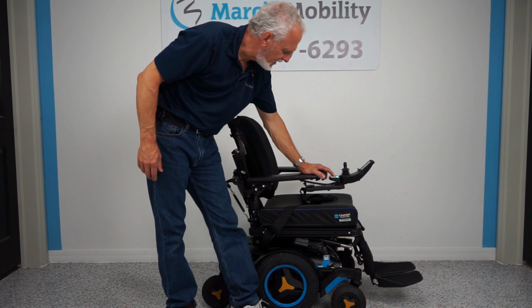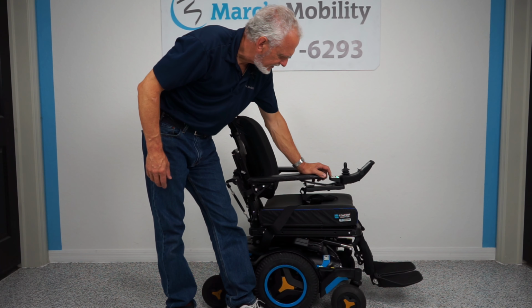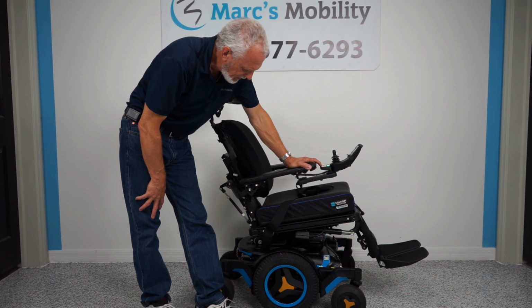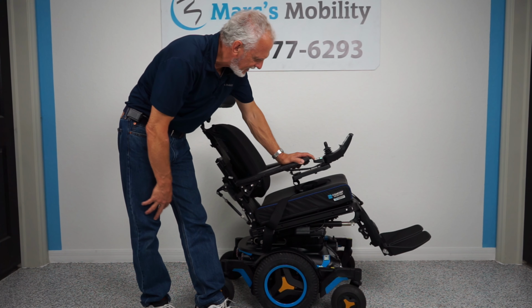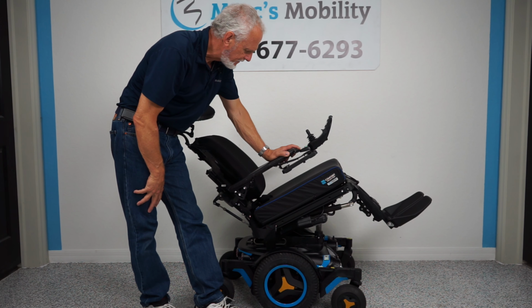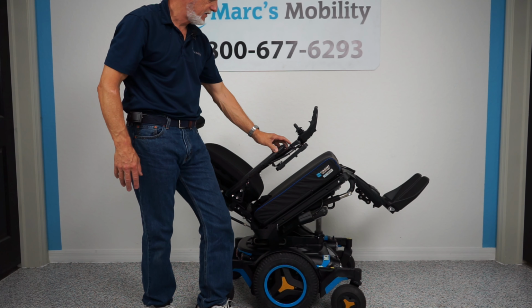So the first button is called the electric tilt. The electric tilt is when the bottom right here goes back. When the bottom goes back, it's going to take the legs and it's going to take the back because they're all connected together. This is called your electric tilt.